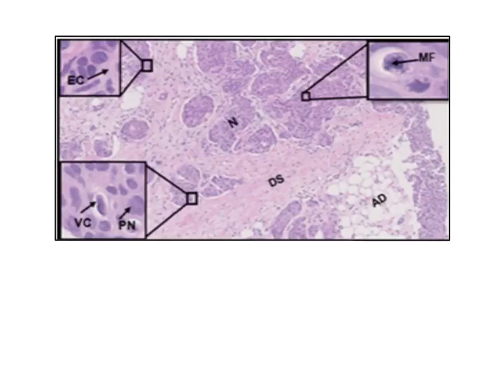This invasive ductal breast carcinoma spreads irregularly through the desmoplastic stroma, DS. Usually when carcinoma cells penetrate the stroma, they originally invade the fibrous tissue, then the fibroadipose, and lastly the adipose tissue, AD. Myoepithelial cells portray a lack of visibility with invading malignant cells, which have breached the basement membrane and have resulted in the invasion of the stroma due to the constant proliferation.